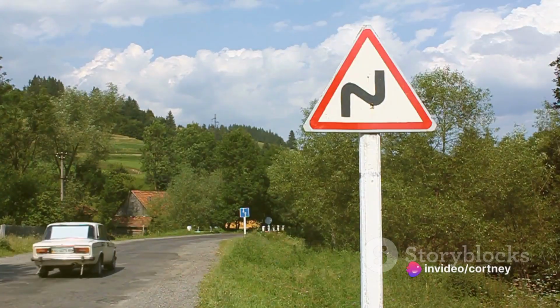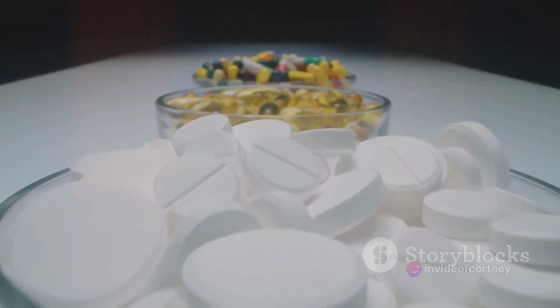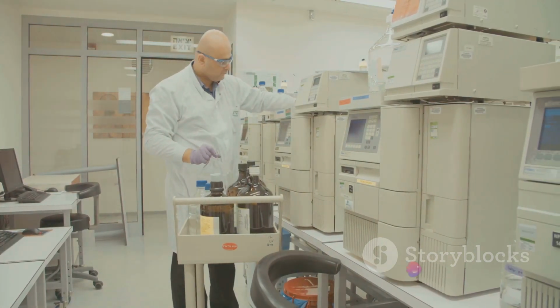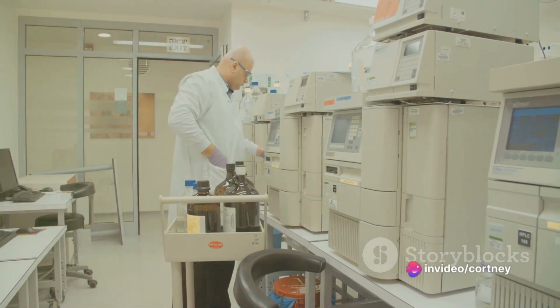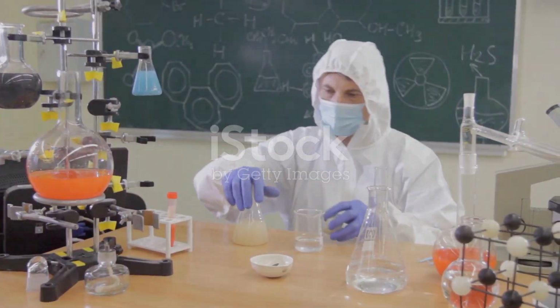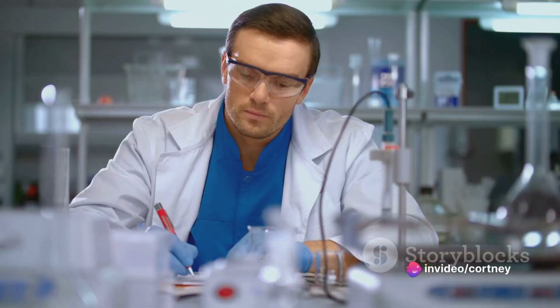Like a rough diamond, the results can sometimes be misleading, with false positives occasionally cropping up. The reasons for this can be various, ranging from the presence of certain medications to specific dietary habits. But to confirm a positive result from the immunoassay test, we need to perform another test, a more specific one called gas chromatography. Gas chromatography, or GC, provides the specificity needed to confirm a positive drug test. Now, let's delve into this fascinating process that separates and analyzes compounds.